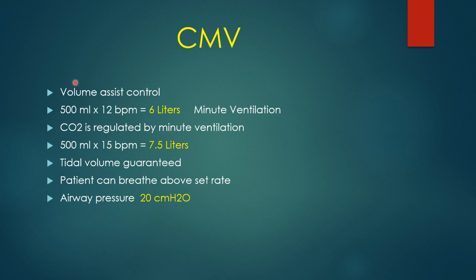So the patient is still paralyzed, not breathing. He's in la-la land. So the ventilator is giving him 12 breaths every minute, and his tidal volume is 500. And so you know about minute ventilation, right? The minute ventilation is the tidal volume times the respiratory rate. That's how much air the patient is breathing per minute. This is what regulates the CO2.